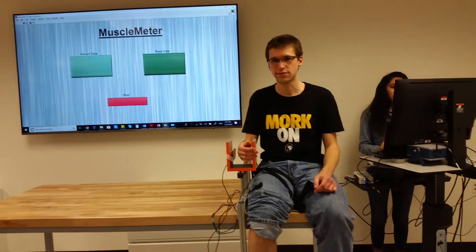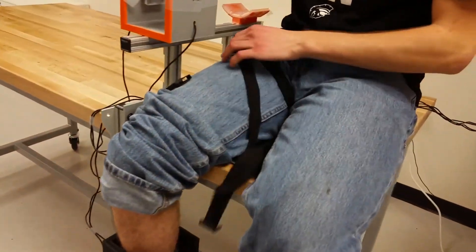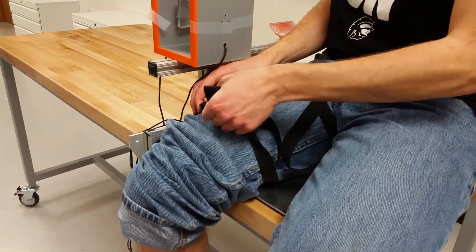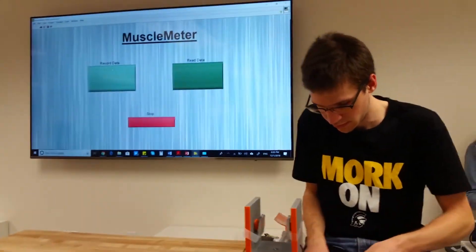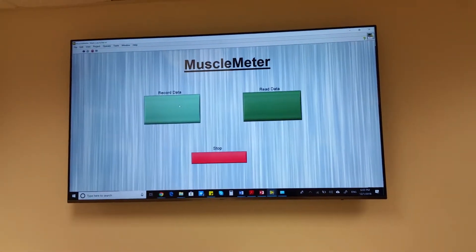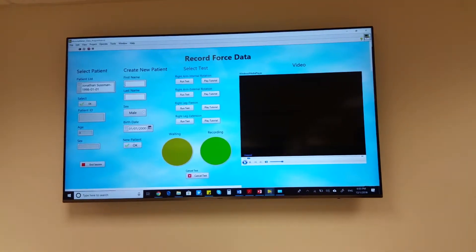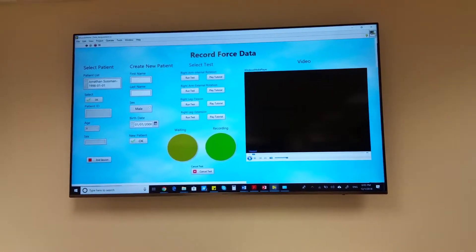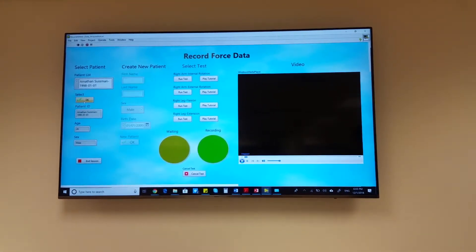The patient is instructed to sit on the plate, and the straps are fastened around the right leg tightly so that the leg is immobilized. A technician opens up the main launcher where they are prompted with two choices: record data and read data. The technician first chooses to record data, launching the data acquisition application. The technician has the choice to either select an existing patient or create a new patient. In this case, we will select an existing patient.